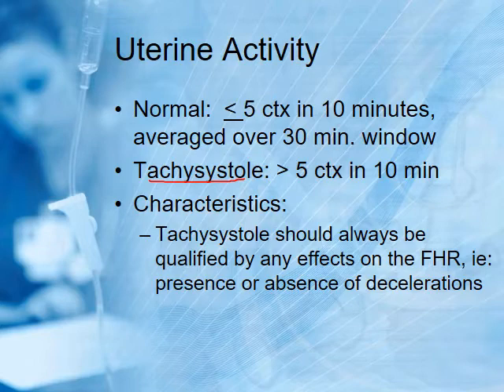Remember that for every minute the uterus is tight in a contraction, there has to be a minute of relaxation for that fetus to recover. And with tachysystole, with more than 5 contractions in 10 minutes, that baby is not getting recovery time. Tachysystole should always be qualified by any effects on the fetal heart rate. So we're going to talk about them as well, whether there are decelerations of the fetal heart rate. So we don't evaluate them all on their own. We always have to look at the effect on the fetal heart rate.